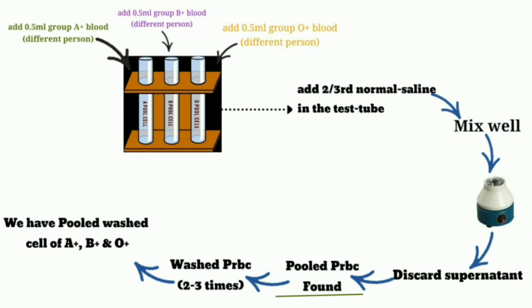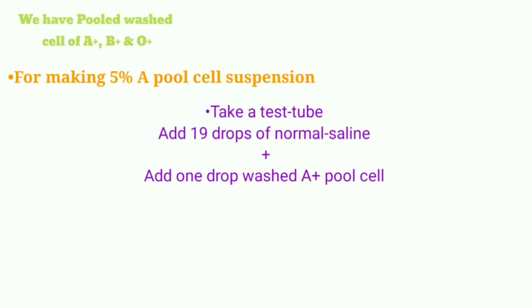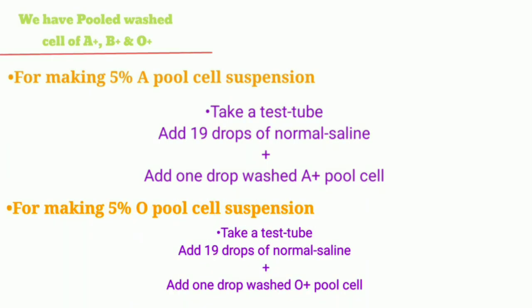These pooled PRBC then undergo a washing process 2 to 3 times. How you wash PRBC, I explained in my previous video part 1. When the washing process is complete, we have pooled washed cells of A positive, B positive, and O positive. Now we are ready for the preparation of pooled cell suspension.